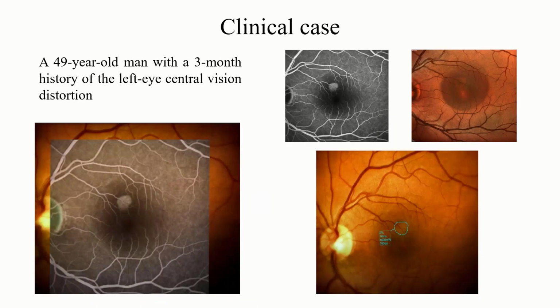This slide presents a clinical case of a patient with CSC with a sufficiently large detachment of the RPE. To determine the localization of the RPE detachment and create a treatment plan, fluorescein angiography was performed. The treatment protocol is shown on this slide.